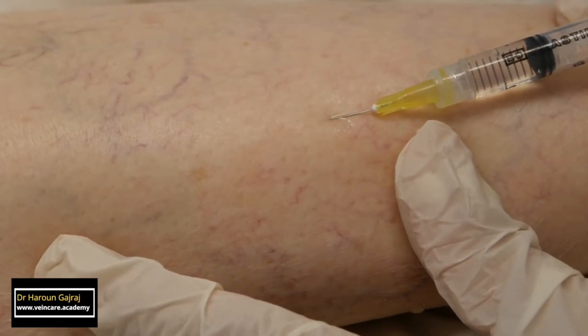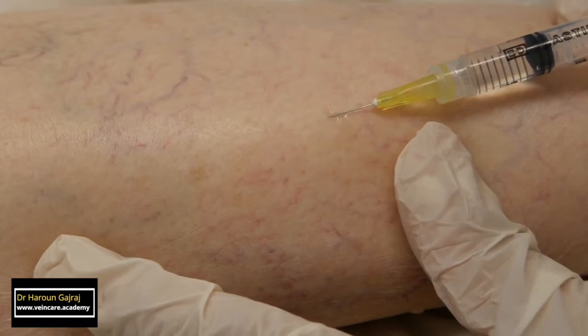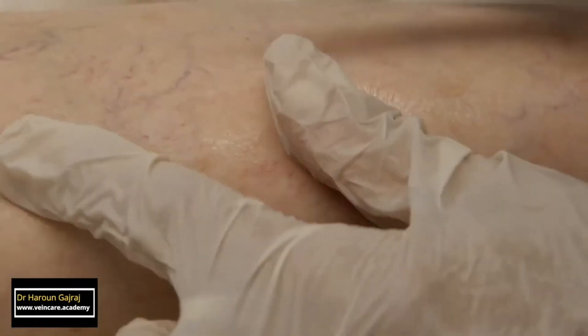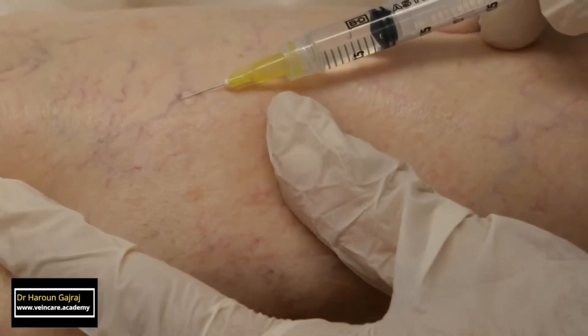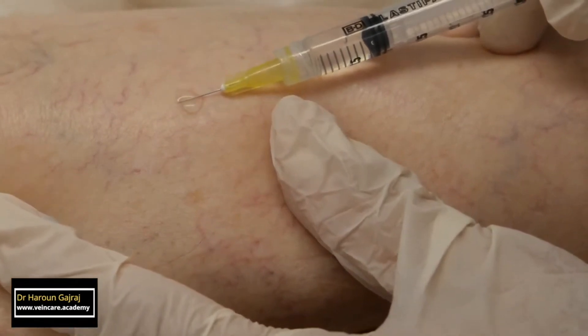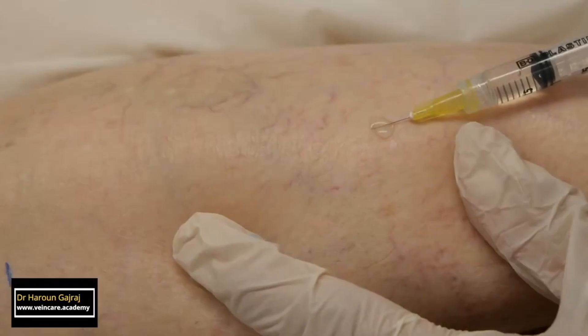As the needle is advanced, the vessel is successfully cannulated, and you can see blanching once again. I inject small volumes of sclerosant under low pressure. Before removing the needle, I hold the needle and the piston still for a few seconds to allow additional contact time between the sclerosant and the endothelium.